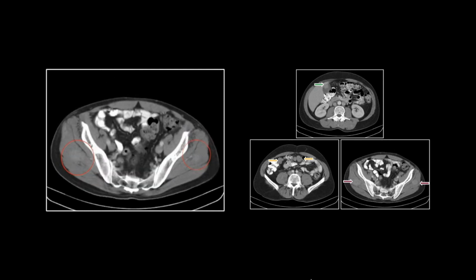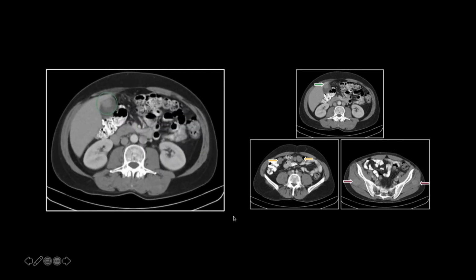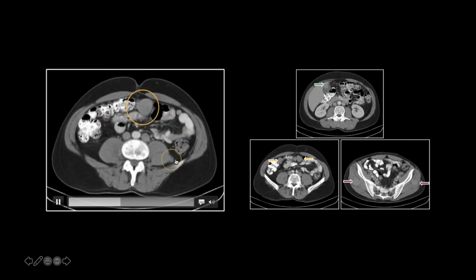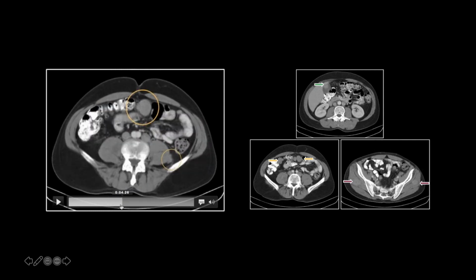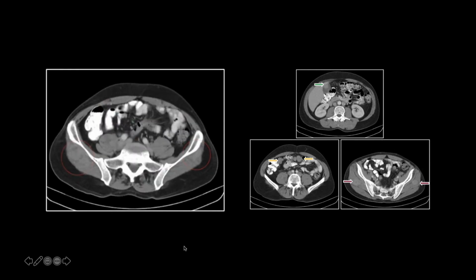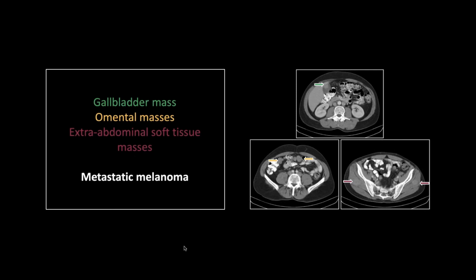This is another one that demonstrates the importance of that retroperitoneal node, right? You can see I circled it here on the left. This caught my eye, right there. And I always remember presenting that at our tumor board and saying, "That's what caught my eye first," and made me say, "There are mets." And someone said, "Oh, come on, that." I said, "I look there every time and it's always clean." Right? That can be a really valuable tip. All right, so that is metastatic melanoma.